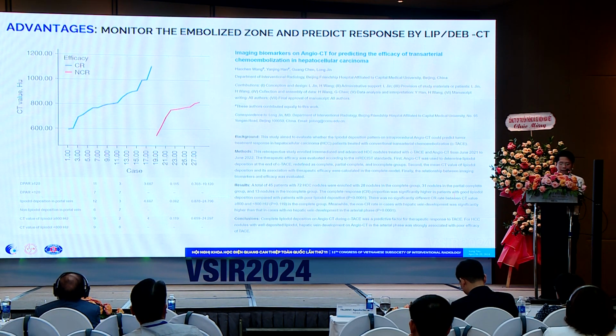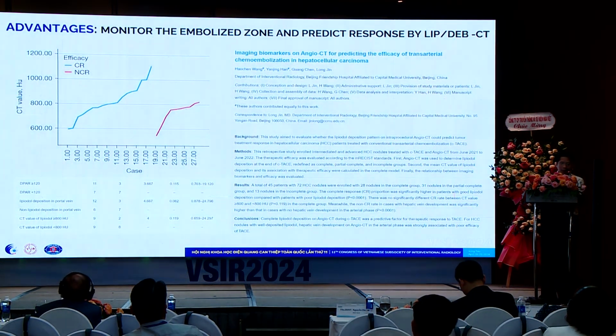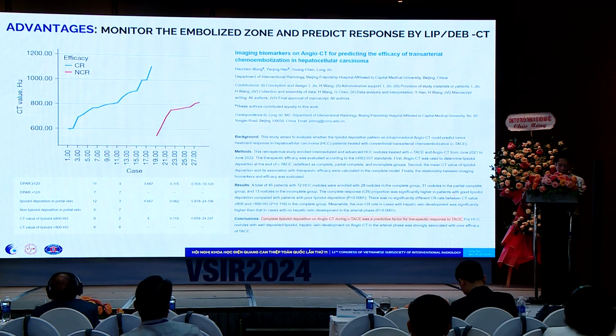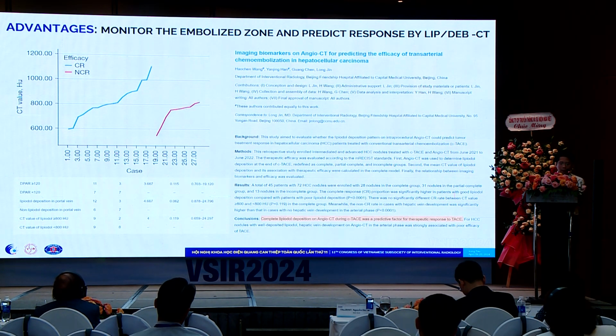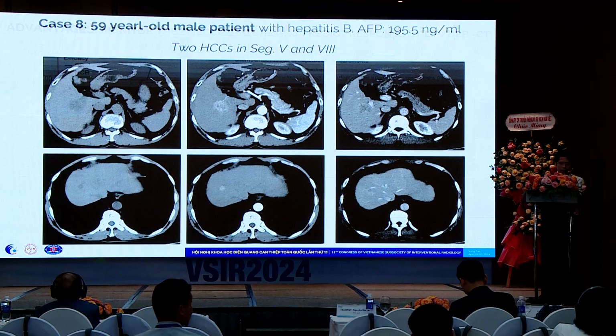And finally, the last advantage is that Lipiodol CT can monitor the embolized zone and the clinical response. Recent research has shown an imaging biomarker that can predict the efficacy of TACE, and among them, the complete lipiodol deposition on angio-CT is an important predictive factor.